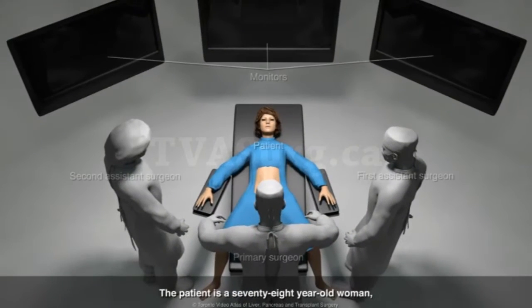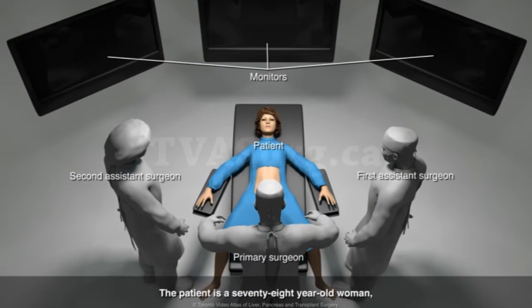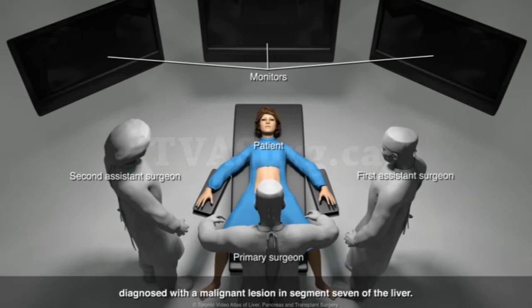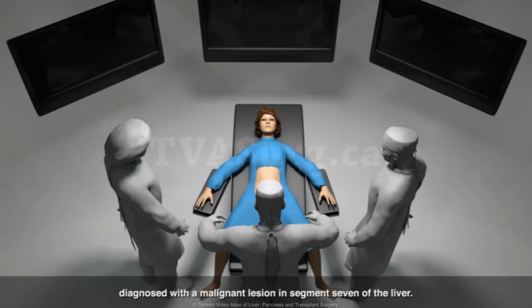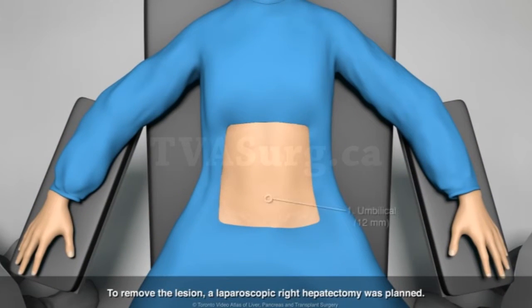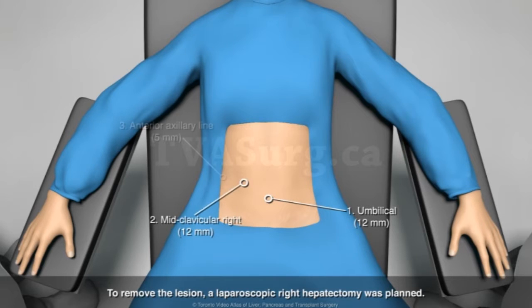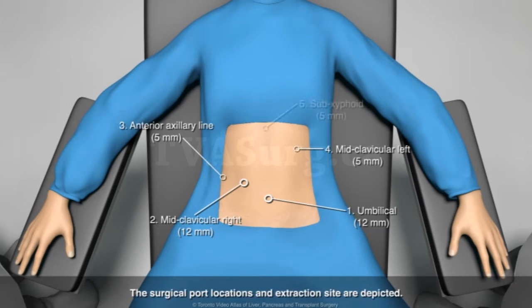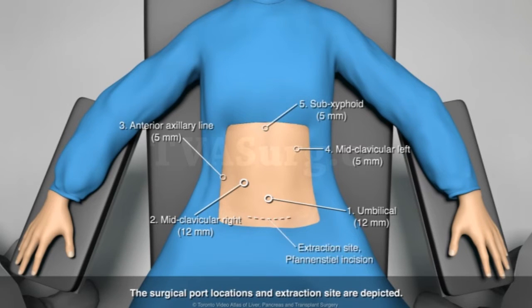The patient is a 78-year-old woman diagnosed with a malignant lesion in segment 7 of the liver. To remove the lesion, a laparoscopic right hepatectomy was planned. The surgical port locations and extraction site are depicted.